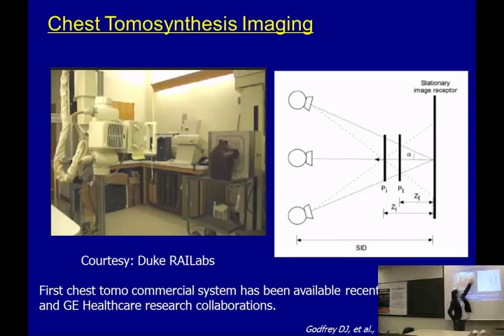This is the detector of traditional two-dimensional X-ray imaging. And this brown one is the chest phantom to mimic human tissue. And this one is the traditional X-ray tube. When we upgrade to a tomosynthesis device, we can move the tube up and down to take a sequential order of projection images. If we look at it in a mathematical way, this shows the tube's locations, and this is our detector, so we can take multiple projection images and then reconstruct slice by slice. Okay, next.